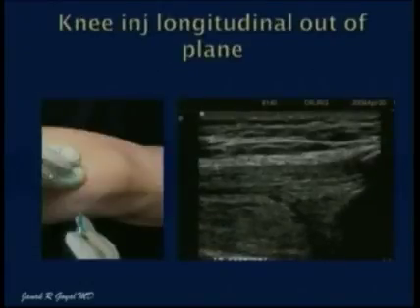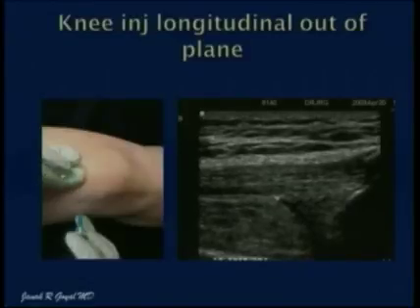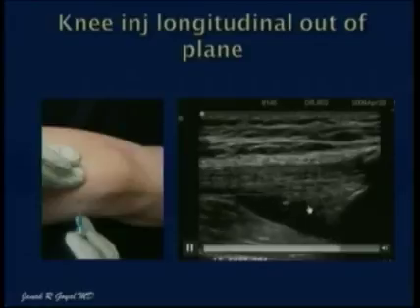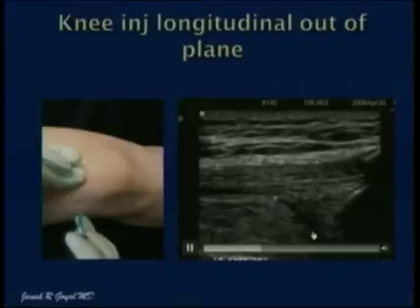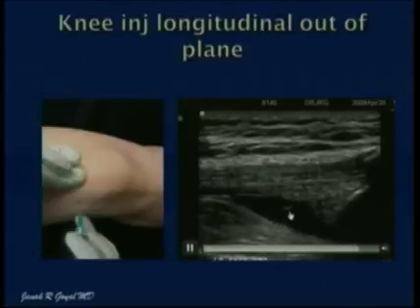Here is a longitudinal approach. You see this positioning of the transducer, but the needle is out of plane. You're seeing that needle just as a dot, but here is the suprapatellar recess. You see the suprapatellar recess being filled with the material clearly.